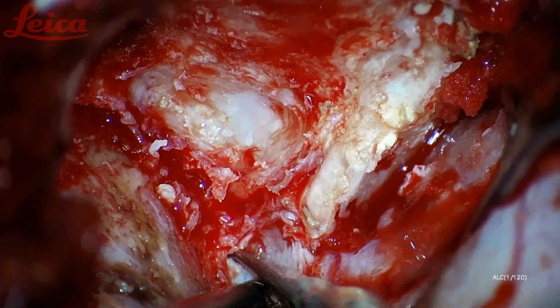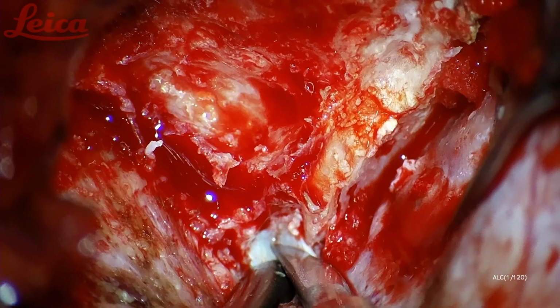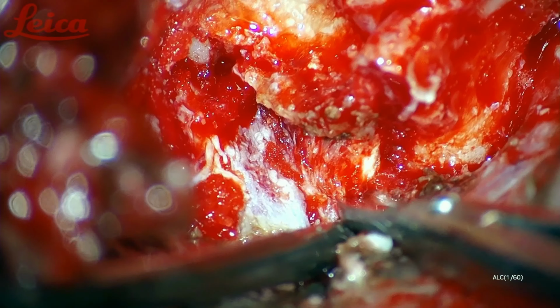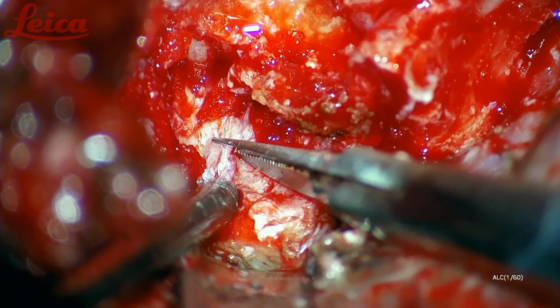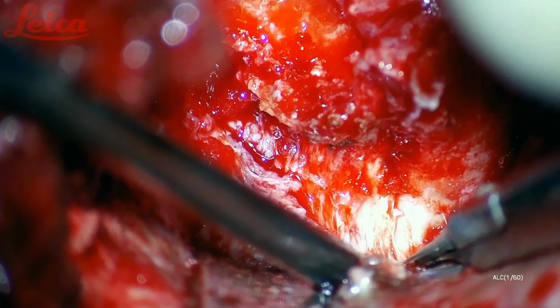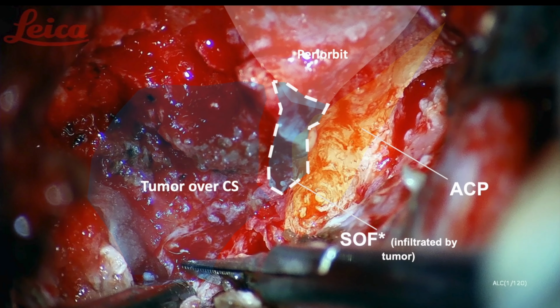Then, the peeling of the middle fossa is performed by combining sharp dissection techniques and gentle dynamic retraction of the dura propria using the suction tip. Peeling is performed from a medial to lateral direction so that this maneuver allows to expose the tumor over the lateral wall of the cavernous sinus, the tip of the anterior clinoid process, and the Meckel cave.